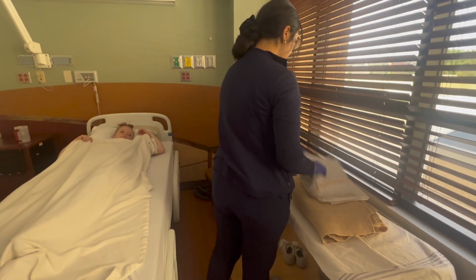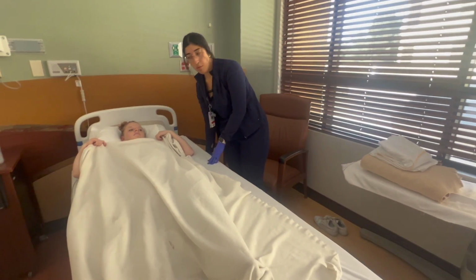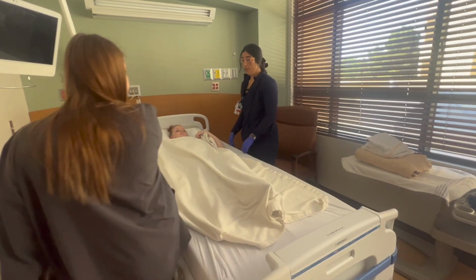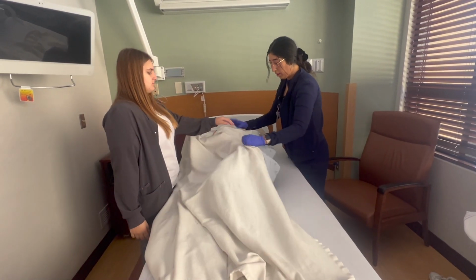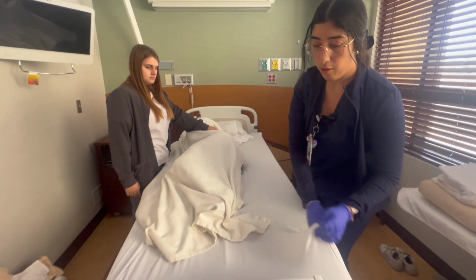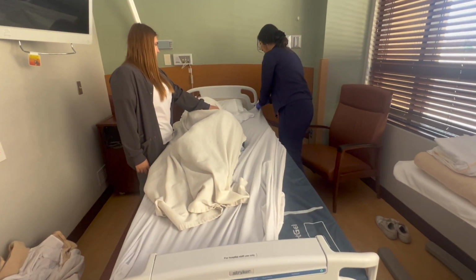We're going to start with our fitted sheet. So what we'll do, I'm going to raise it a little bit more. And I'm going to ask my test observer to come over so that we can turn her and start to take off the dirty linen. So we're going to turn this way and we're going to keep her covered. And we're not going to allow her bare body to touch the bare mattress. We're going to remove this.